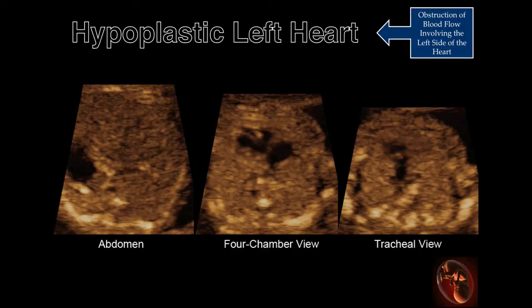These three images are obtained from a transverse sweep from the abdomen to the upper chest. What is abnormal?